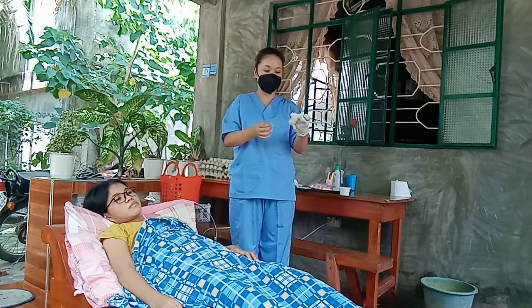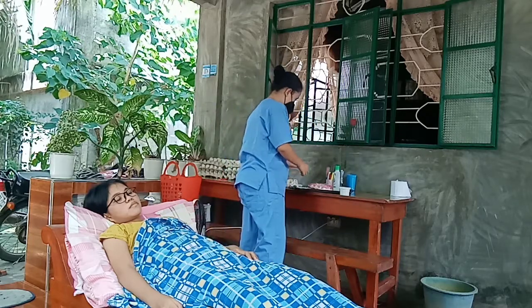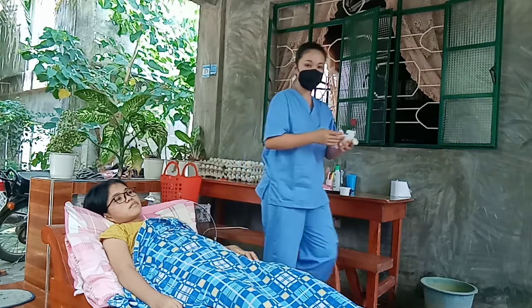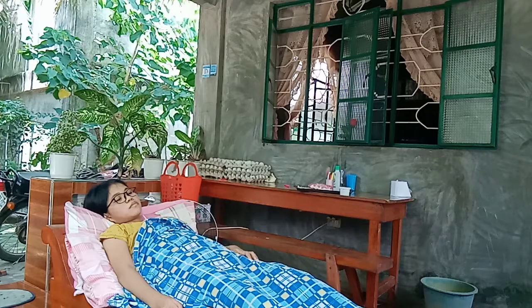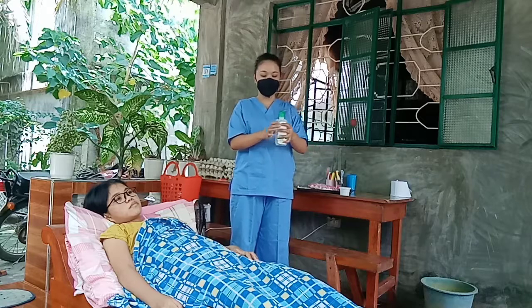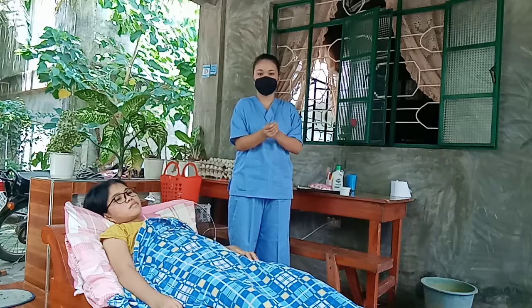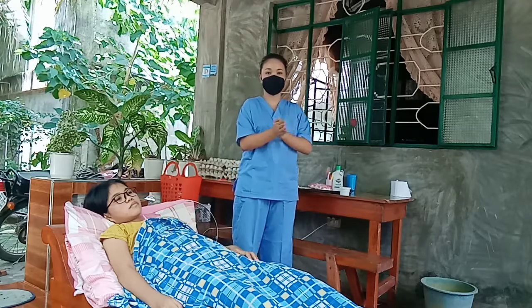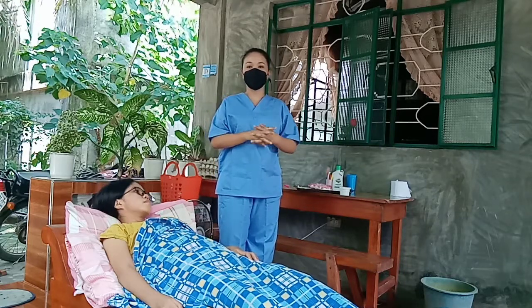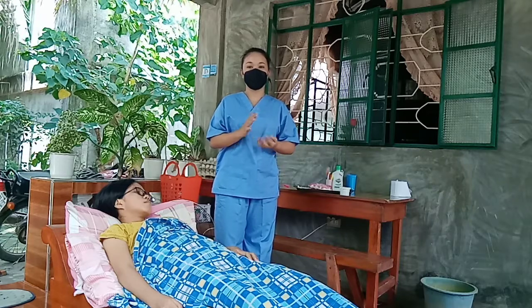So dispose and remove the soiled gloves. Then, perform hand hygiene. Then next, send this specimen and requisition to laboratory within 20 minutes or refrigerate specimen if necessary.